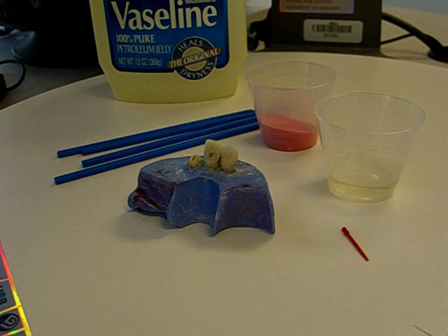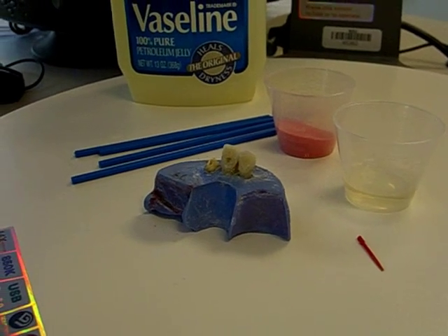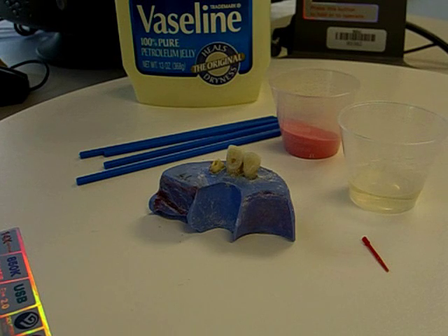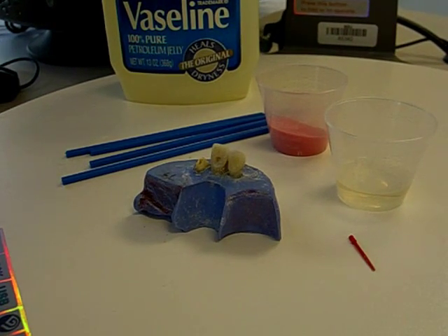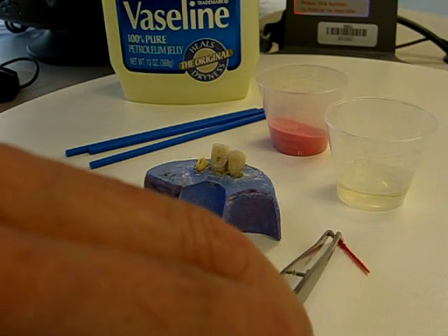Once I do that, the next step is to begin the lining of the acrylic post — the power post. So the first thing I'm going to do is wet the side of the post with the GC pattern resin monomer. For that, I'll use a micro brush.